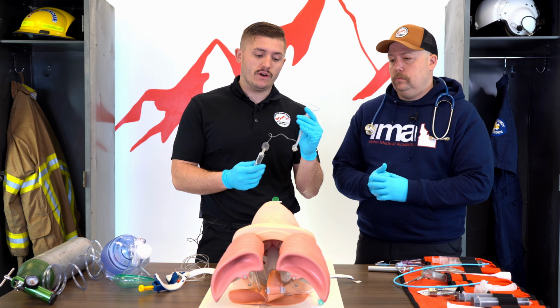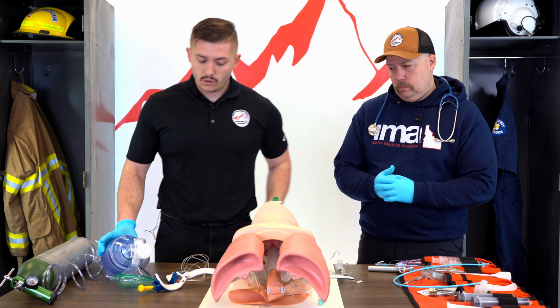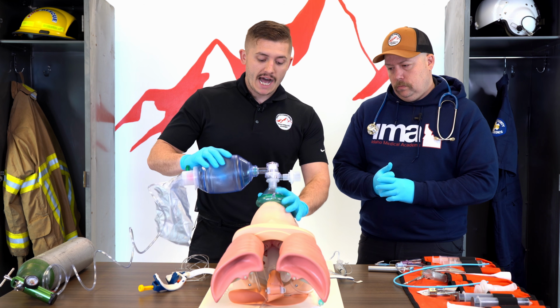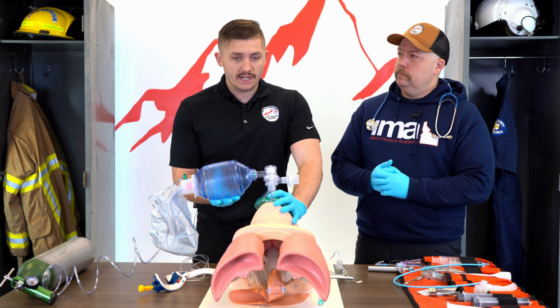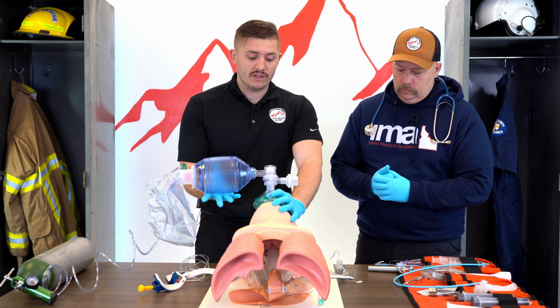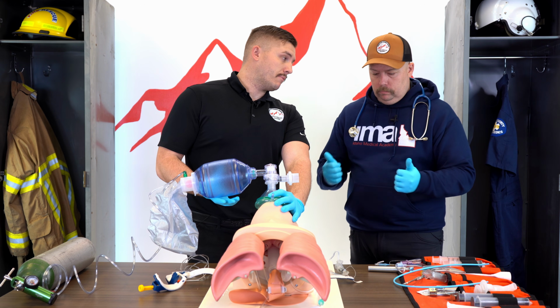Again, we're going to have to secure it, but we'll show you what this would look like on an actual call. So again, I'm the EMT basic. I've got my OPA in, I got my NPA in. I'm managing the airway. Chris has been doing his paramedic skills this whole time, getting an IV, maybe getting an IO, giving medications. Now he's ready to take over the airway. Say, all right, Chris, I got an OPA in. We got good compliance. You just let me know when you want me to pull the OPA.